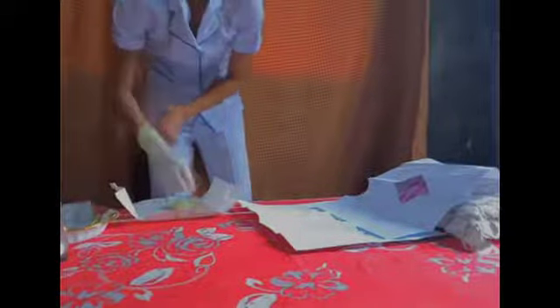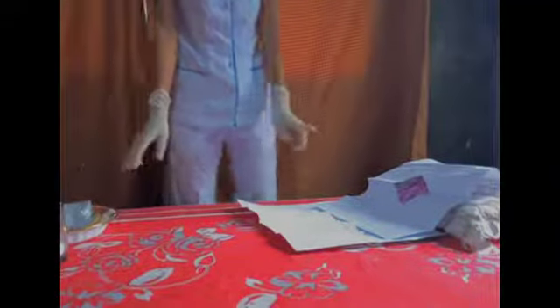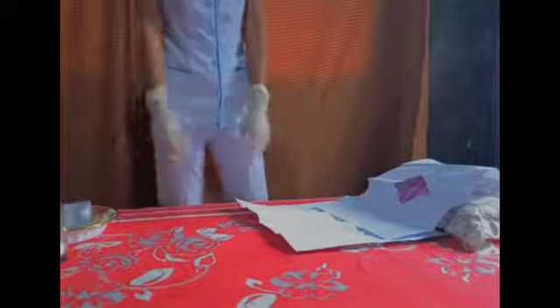We will now remove the first set of gloves and put on another set of sterile gloves. Also, I want to mention that the size of the catheter is 12 to 14 French for a female patient, and the length of insertion is three to four inches.